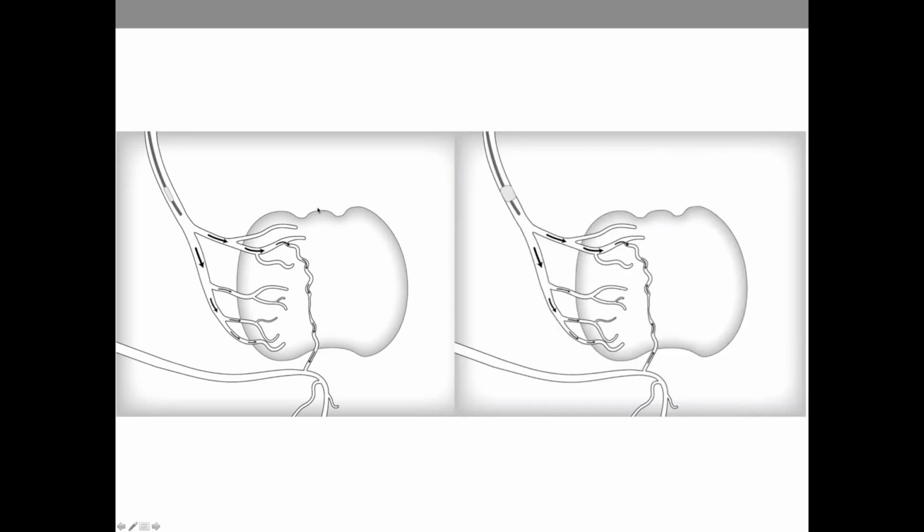When you put the balloon up, now you've blocked all flow around the catheter and you have a low pressure area here. That's going to create a pressure gradient that draws blood flow up through that anastomosis. So you're reversing the flow in that anastomosis. And you can imagine how, if you were embolizing, that would be a nice protective feature with flow coming up this way to keep particles from going through the prostate to other places. And I'm going to hope to demonstrate that in a case that I'll show you in a second.